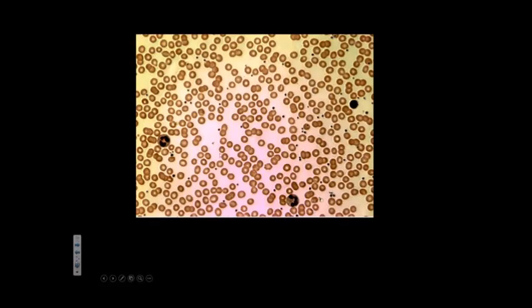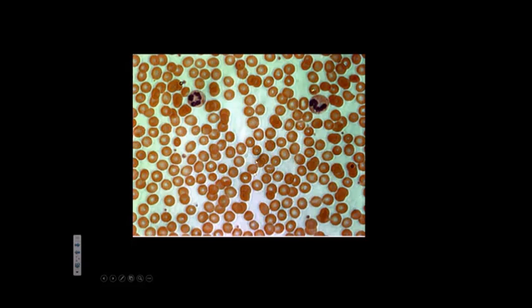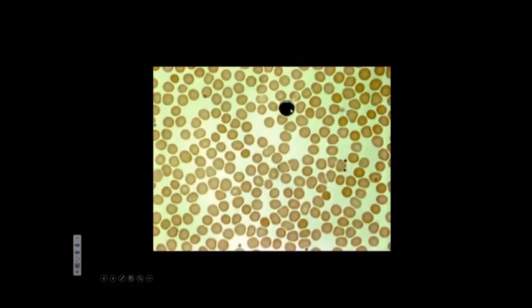So this is a different magnification, smaller. Two neutrophils and a potential basophil. Neutrophil, neutrophil, two neutrophils, neutrophil, possibly a basophil. Eosinophil, right? You all agree? Okay, so I think we got it. Two neutrophils, two more neutrophils. Lymphocyte, you all agree?